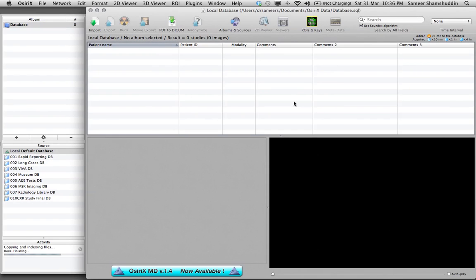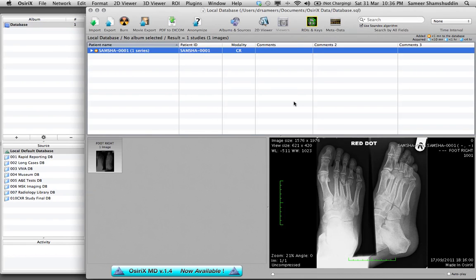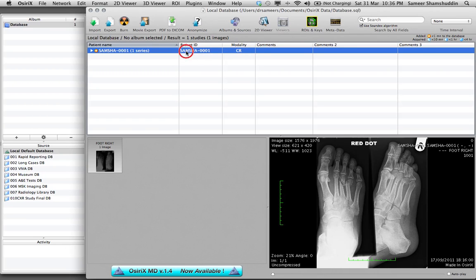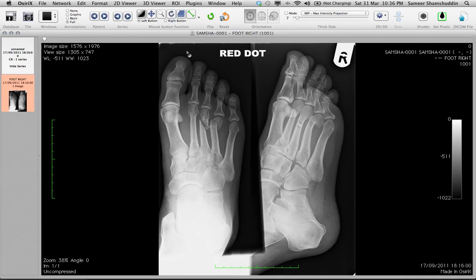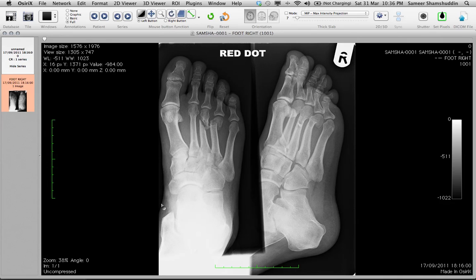Select the folder where you have exported SAMSHA-0001 clean fracture and click open. Select copy files and there you go that's my first case which has been completely renamed called as SAMSHA-0001 CR.